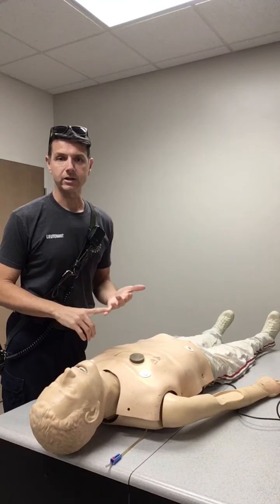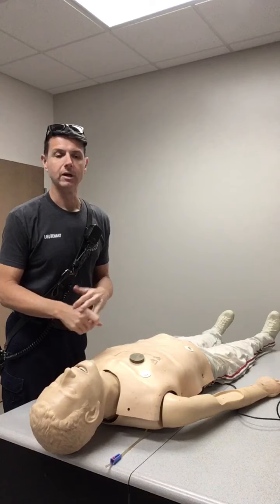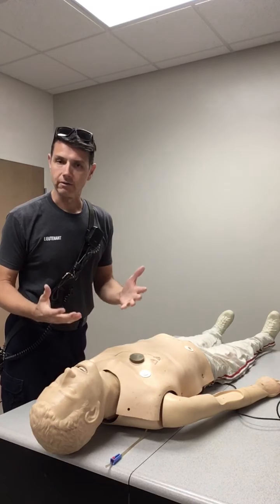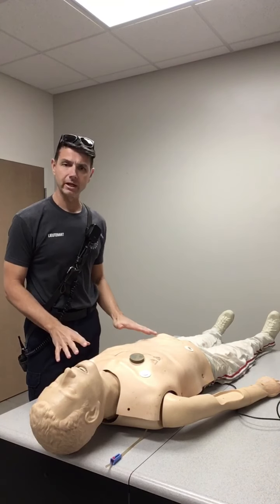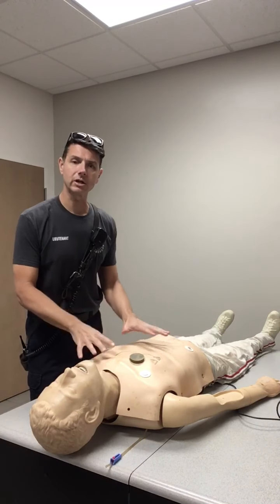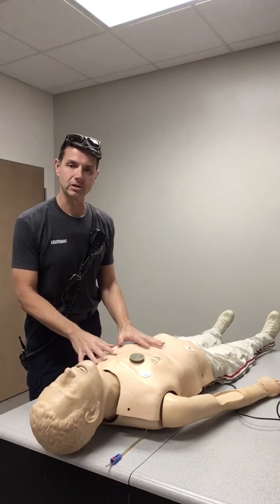So I'm providing oxygen on somebody who needs it, whether it be by BVM or whether it be by non-rebreather, again, if they need it. Then I'm just going to go right into my circulation. I've already assessed for bleeding. If I don't see any bleeding, I'm going to look at this patient's skin. All right, how is my skin presenting?